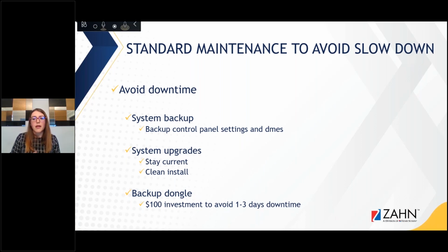I would recommend that every once in a while, if you've been a 3Shape user for 10, 12 years and you've never done a clean install, one, you probably need a new computer. And two, you probably have a lot of materials in there that you're not using anymore, especially implant libraries. That's probably the second most common thing that causes slowdowns besides the database.